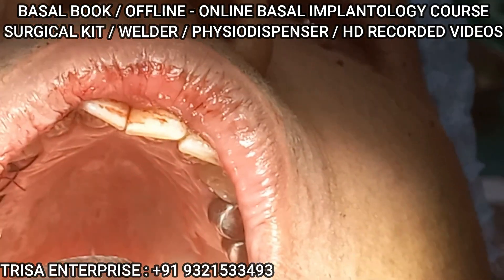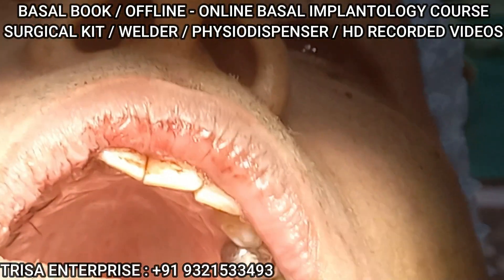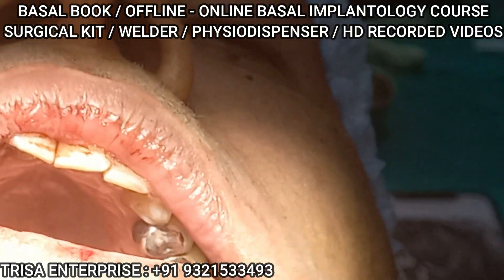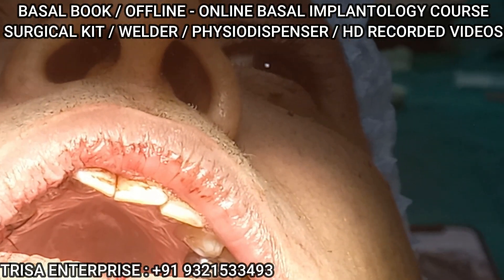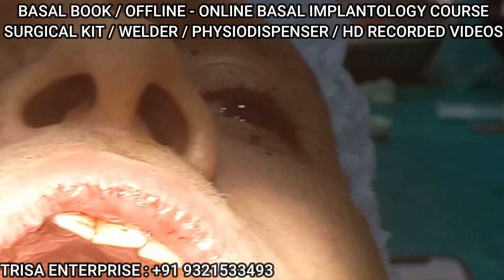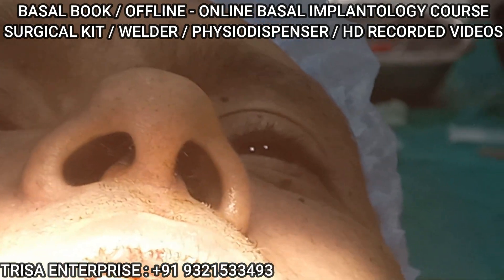Okay, just perforate the floor of the sinus — 5.5, 12. Very slowly; if you're not careful you will go into the sinus. You perforate it, but by placing the implant also you have to be very cautious. If you try to hurry up and do things, you will go into the sinus.